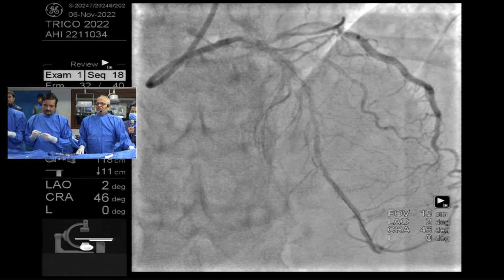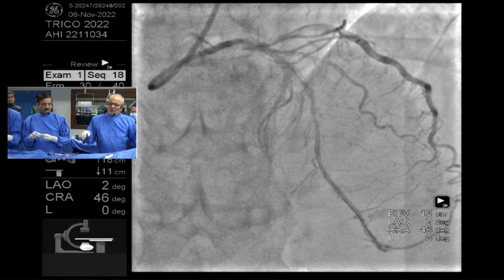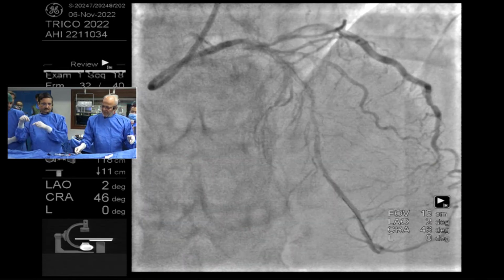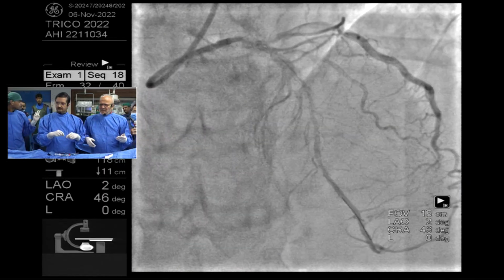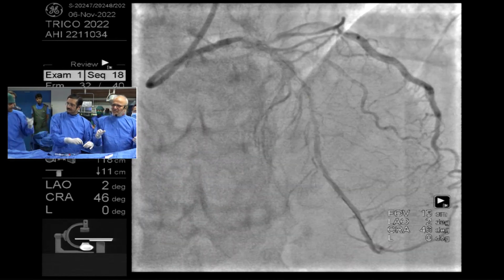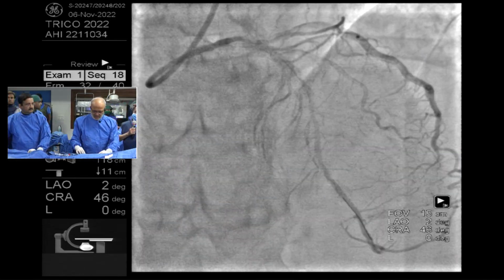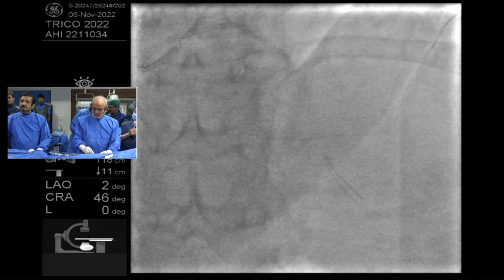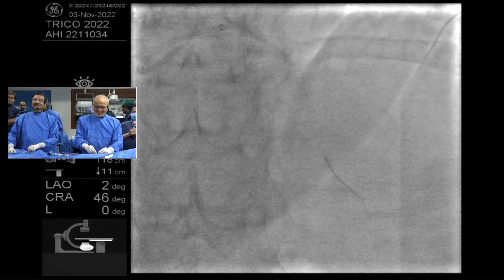Sir, is there any condition where you would go upfront 1,80,000 versus 1,50,000? Never. If you are a beginner, you start with 140, not even 150. And then 150 is our default start, but very rarely we go above 160. In this type of situation only I will think, because it's not going to work otherwise. So we make our fellows hold the burr in their finger and activate it and see how long they can hold it. That's how they know how long to stay on the pedal.